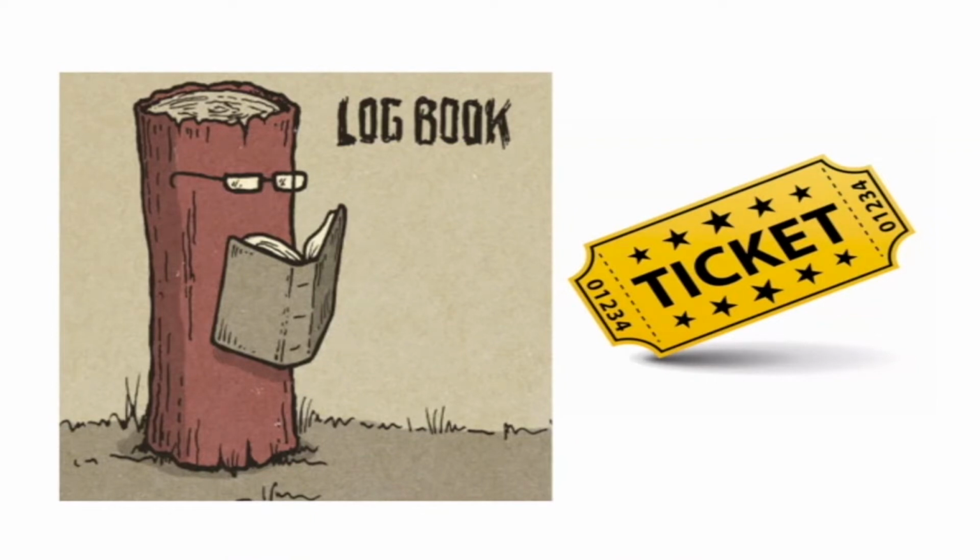You're able to adjust your microscope well, you're able to perform some simple CCC procedures, and you're even able to bend your needle and insert your IOL, which you have already done in the lab. Then that becomes your ticket for your first step in the OT. So I think that will be a very important point.